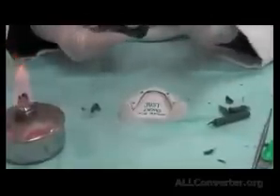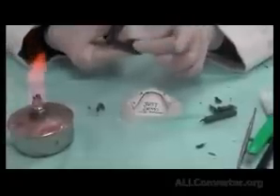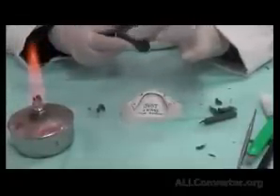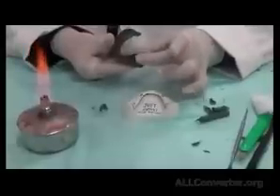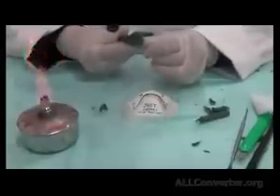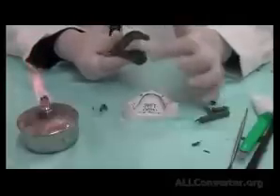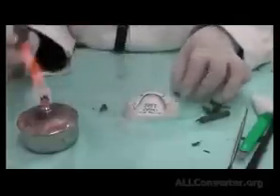Anything on the fitting surface, I remove it. I gather it all together. But look how I am building the material. You remember that some of you faced the problem where the compound did not go into the lingual sulcus. So this is how we force the material to go into the location we want. We build it vertically. So this is the lingual pouch built.